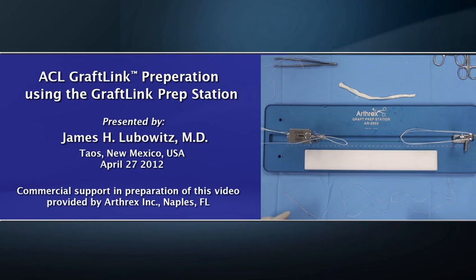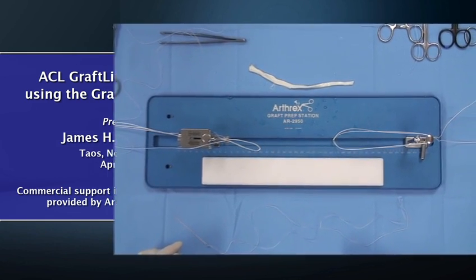This is James Lubowitz from Taos, New Mexico, USA. All inside ACL using graft-link technique is simple and reproducible, but requires meticulous preparation of the graft construct, which we are going to demonstrate today.